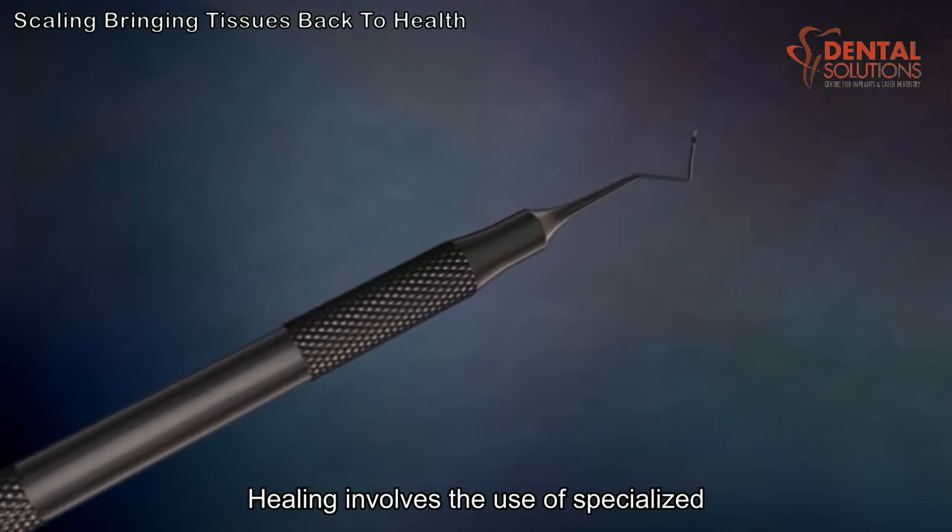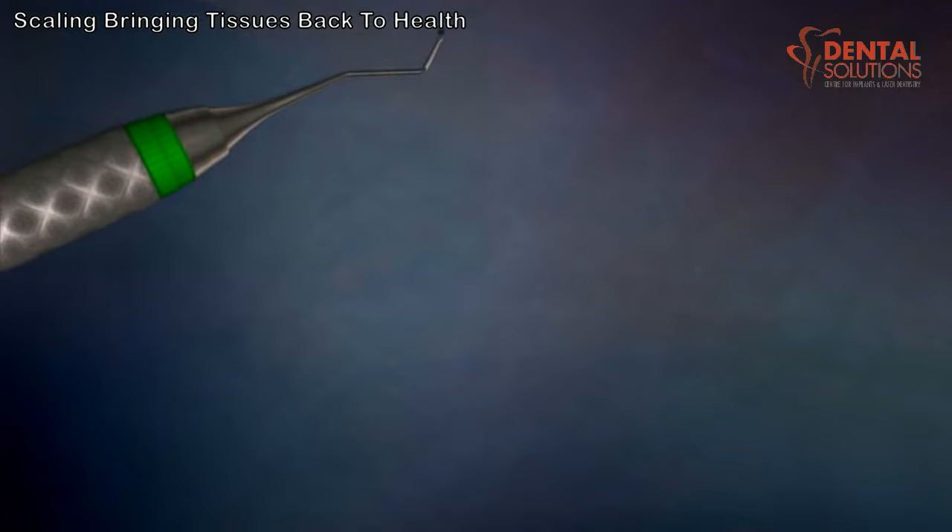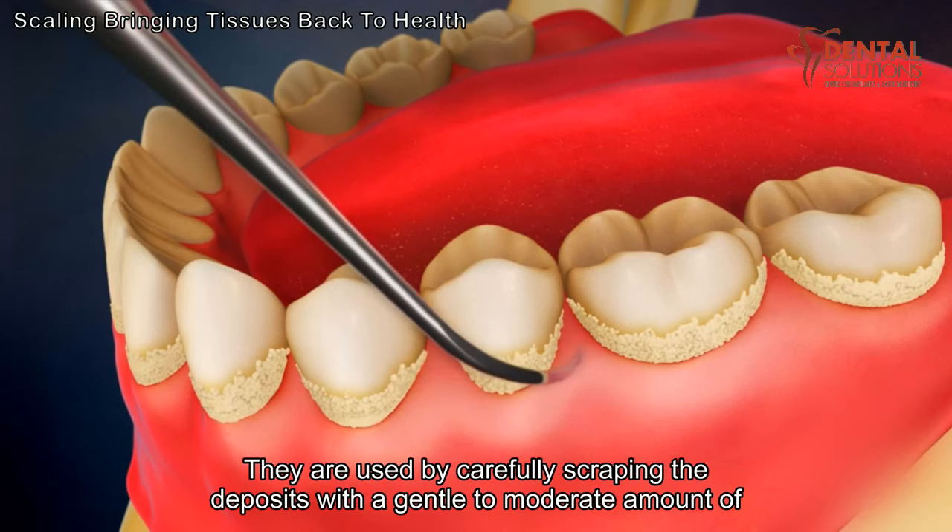Scaling involves the use of specialized cleaning instruments called scalers, which come in different shapes and curvatures to match the natural anatomy of the teeth. They are used by carefully scraping the deposits with a gentle to moderate amount of pressure.